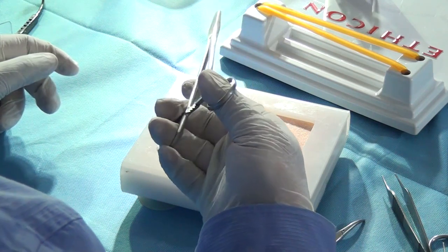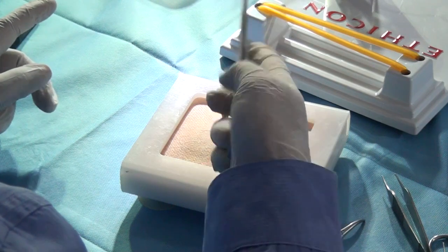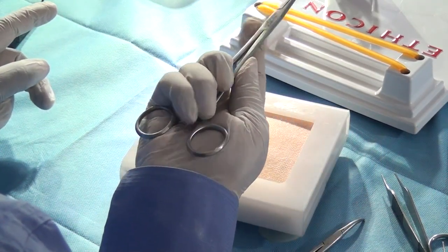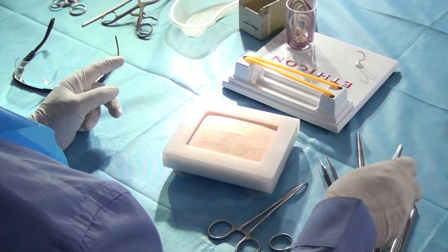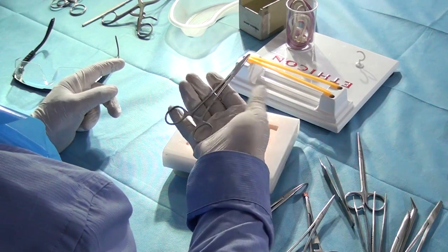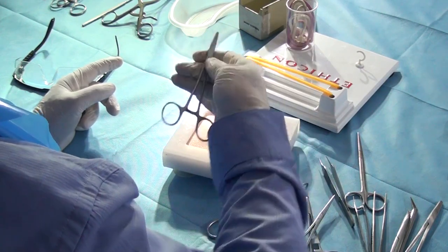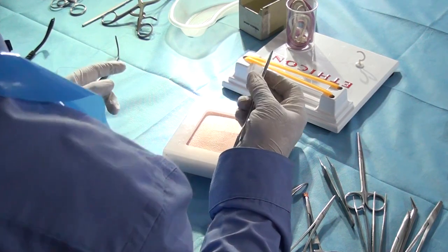The other grip is called palm grip. In knife also I told you about palm grip. Which is this. This is the grip I like to use. What do I do here? My index finger sits here and I can guide it in. My advantage here is I can go back like this if I want to. So I use this part, especially if the needle holder is smallish, say here. I'll use this to take a bite through and go back this way. This way, this way. I can rotate the instrument. I control it rather than instrument controlling me, because that's the key.